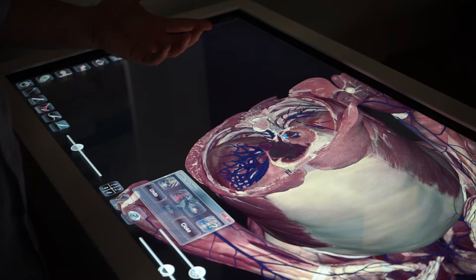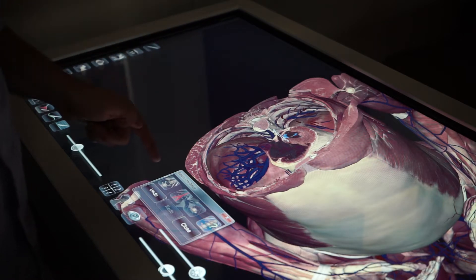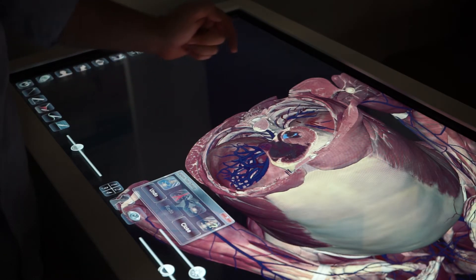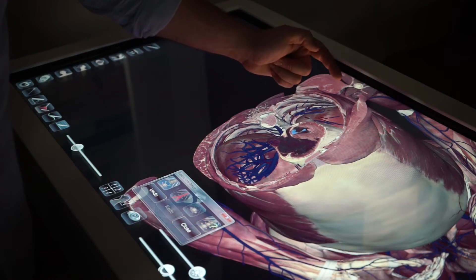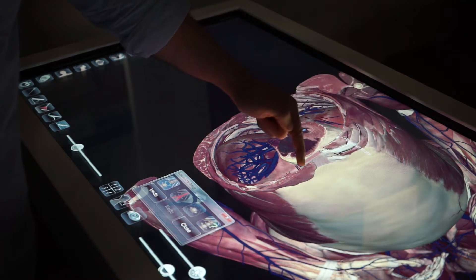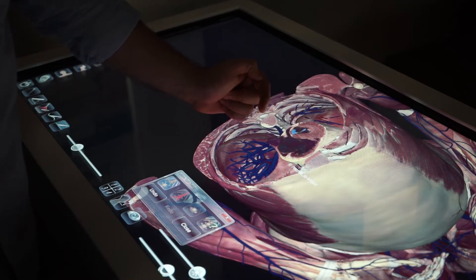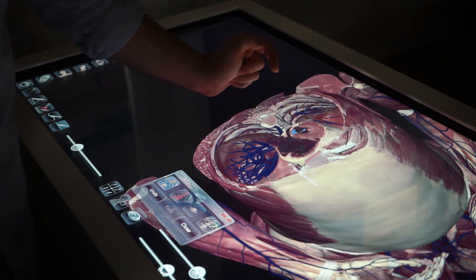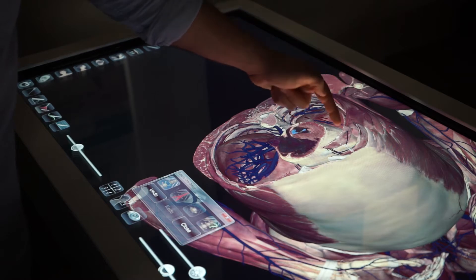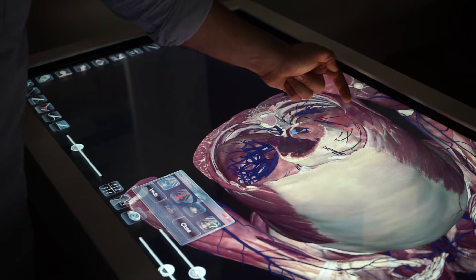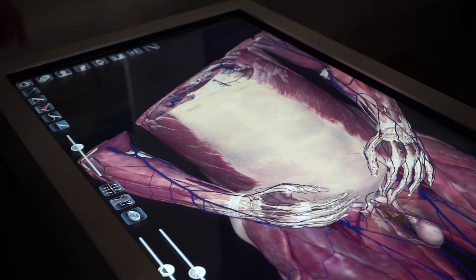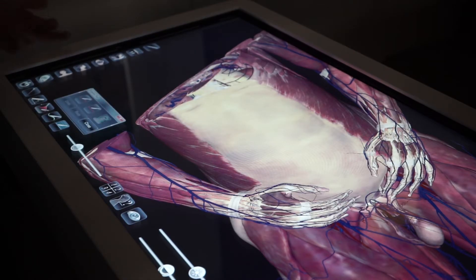I can also extract different parts of the body by using the extracting icon and selecting what I want to remove, automatically labeling as we go. Another helpful tool is the dissection tool.